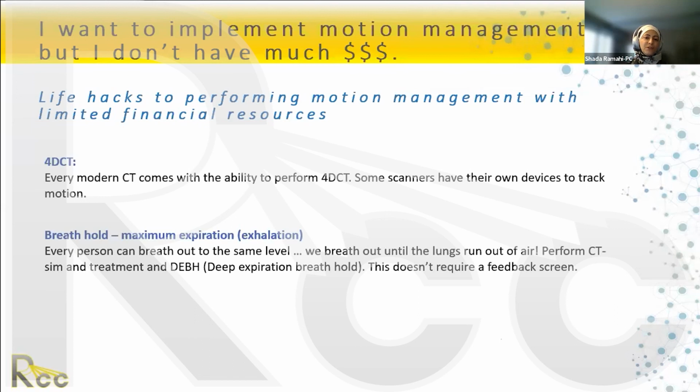If the tumor motion is 5 millimeter or less, and remember, you're looking at 50% as the baseline, and then you see how much the other phases are moving in relation to the 50% baseline, then you generate the ITV from all these different phases. You add 5 millimeter to the ITV, and that's your PTV. And you can go ahead and treat your lung patient with SBRT.